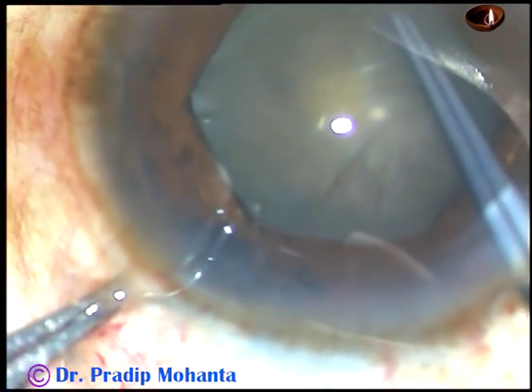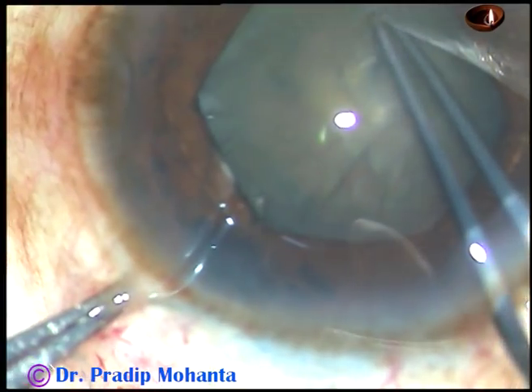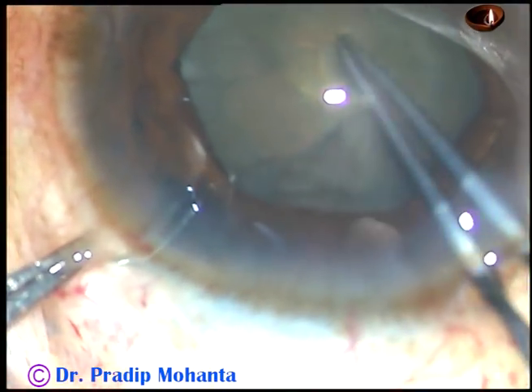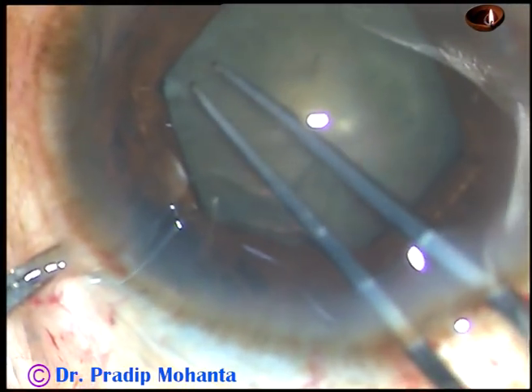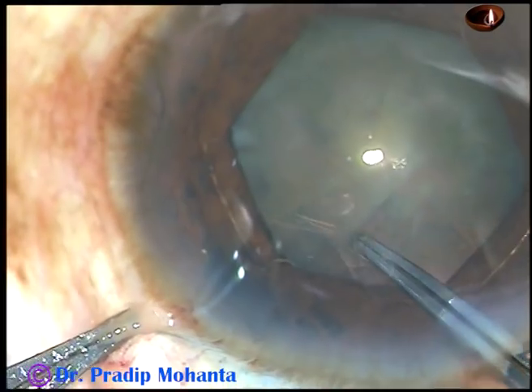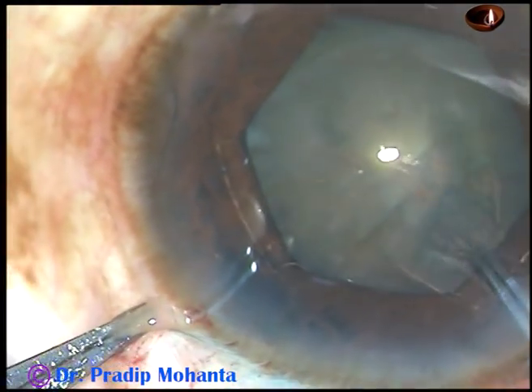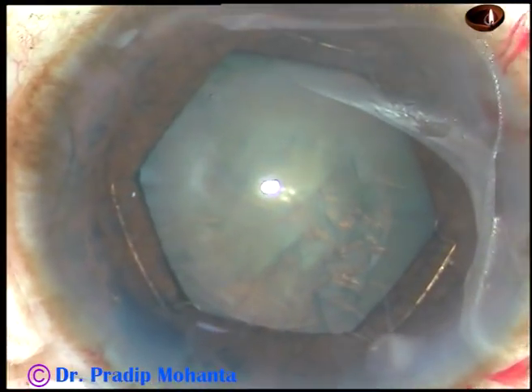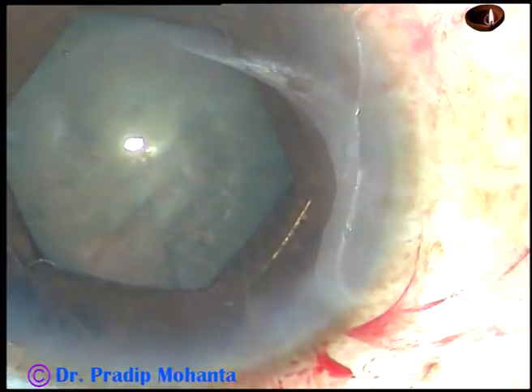The capsule was stained with trypan blue dye. This viscoelastic substance is injected into the anterior chamber, and now a capsulorhexis of about 5mm size is being completed. The rhexis has been completed, and the case went quite well.